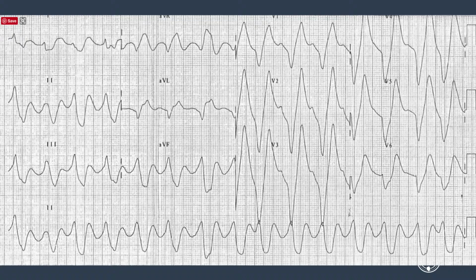Now, his ECG progressed quite quickly into a sine wave appearance, and when calling my consultant, who is potentially the calmest person ever, she slammed the phone down, and I don't think I have ever seen her run quite so fast. Thankfully, the patient did very well and did not end up in cardiac arrest, but it was quite scary at the time.